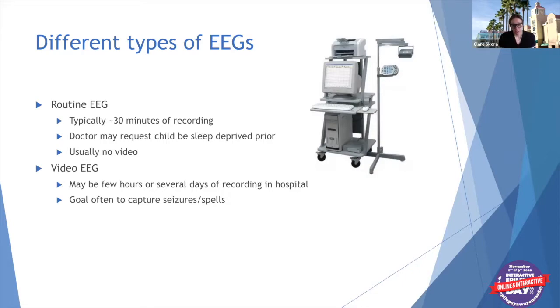And particularly if we know someone has seizures that are very difficult to control with medications, we will bring them to the hospital to provoke seizures to see what they look like from start to end on the EEG, where they come from, to help us guide to see if there may be other options for that child, such as surgical options.